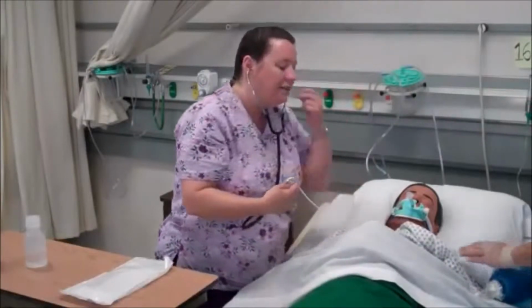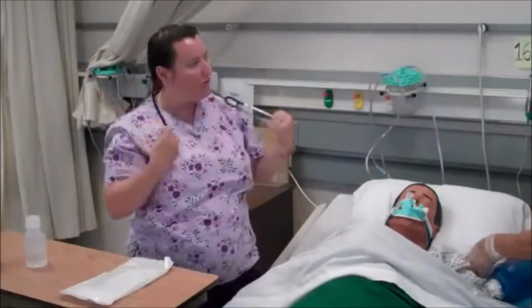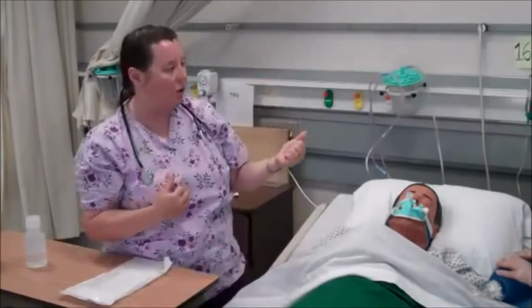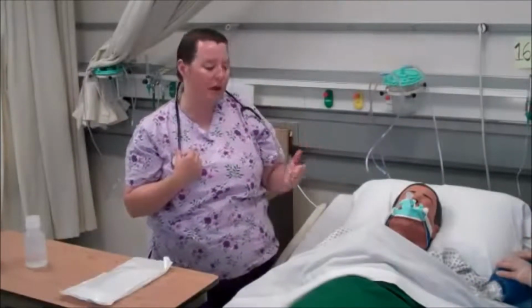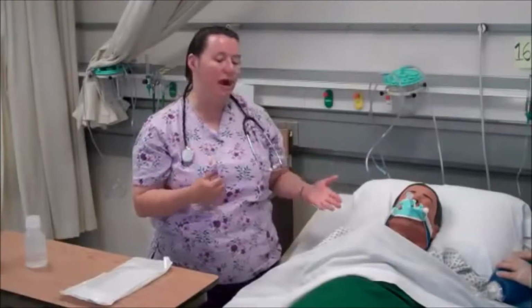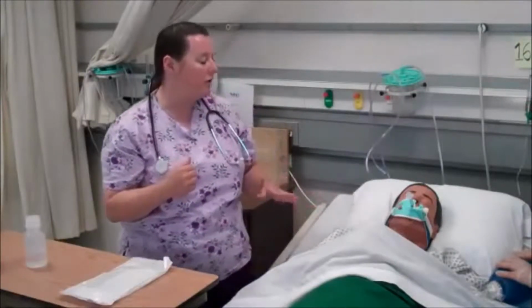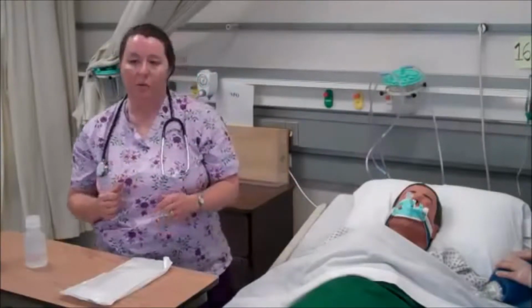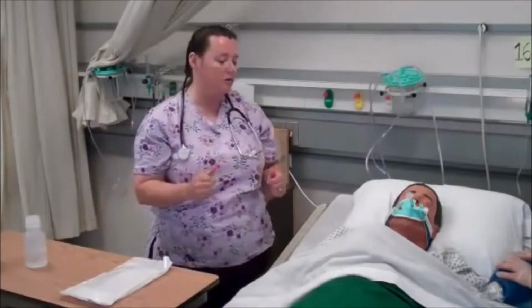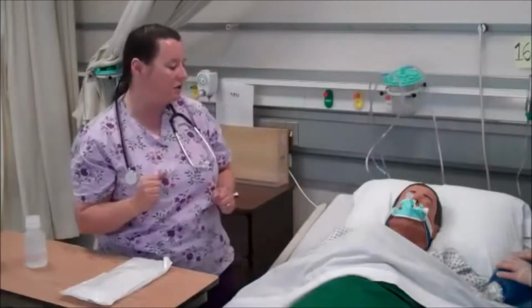What I'm looking to see is if what I hear compares with what I might see on the monitor, which would be a low O2 sat, increased heart rate, increased respiratory rate. I might see the patient is a little bit more anxious, moving about, showing some agitation. The condition would probably warrant suctioning, and my doctor's order authorizes me to do that.